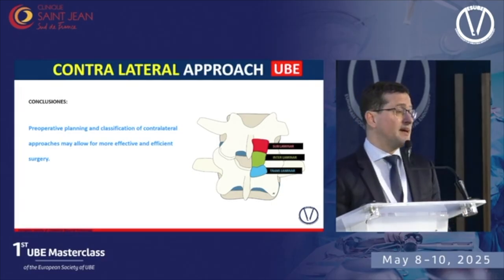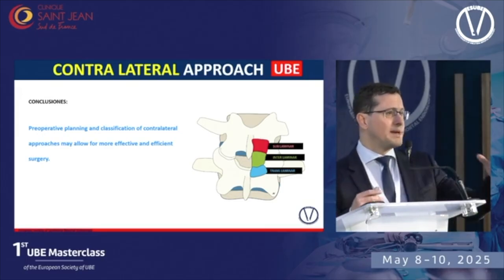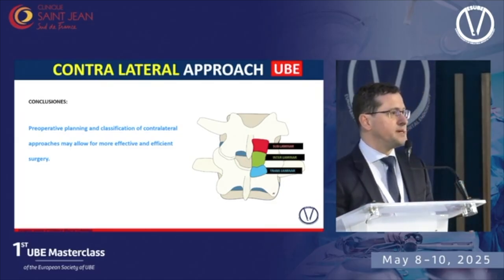But most of our patients have, for example, central canal stenosis, and you have to combine sublaminar and interlaminar approach. Some patients need a translaminar and interlaminar approach. So you have to choose depending on the case of the patient.